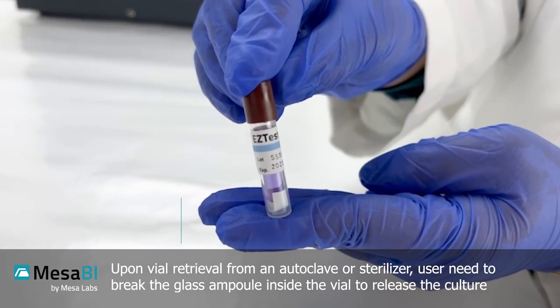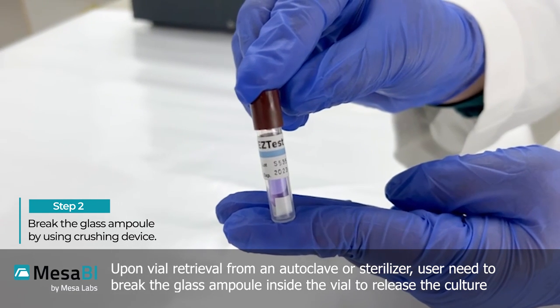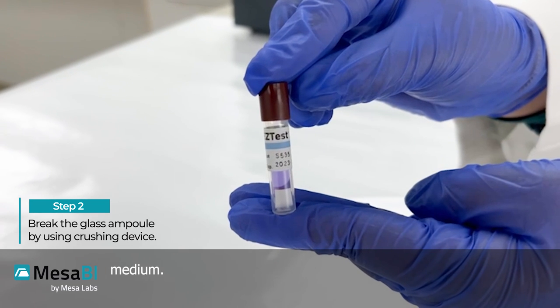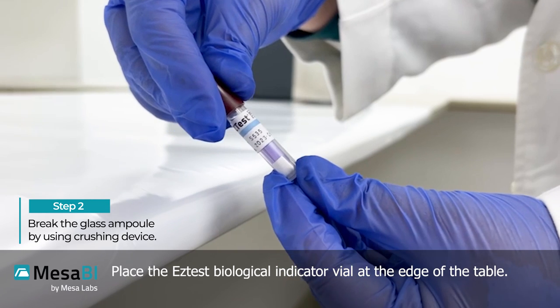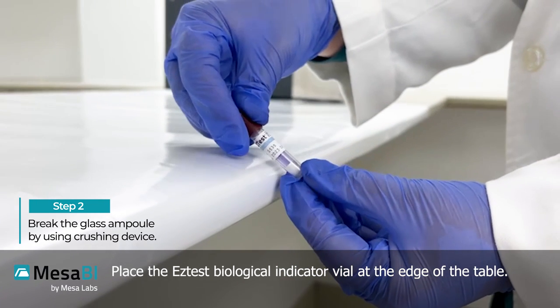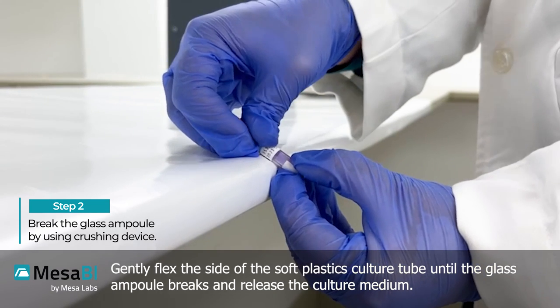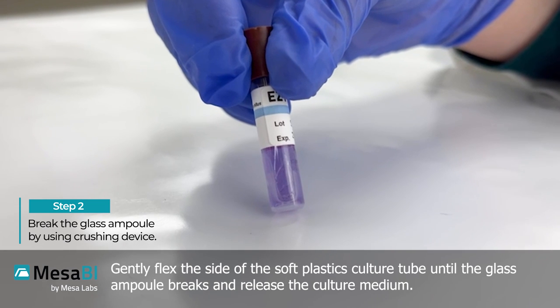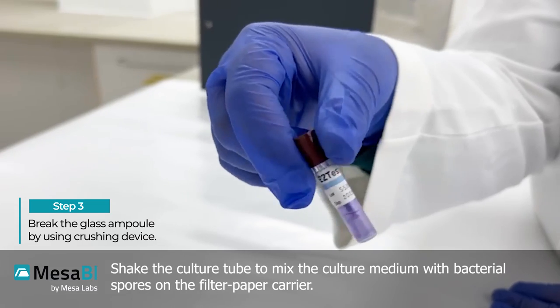Upon vial retrieval from an autoclave or sterilizer, the user needs to break the glass ampoule inside the vial to release the culture medium. Place the Easy Test biological indicator vial at the edge of the table and gently flex the side of the soft plastic culture tube until the glass ampoule breaks and releases the culture medium.